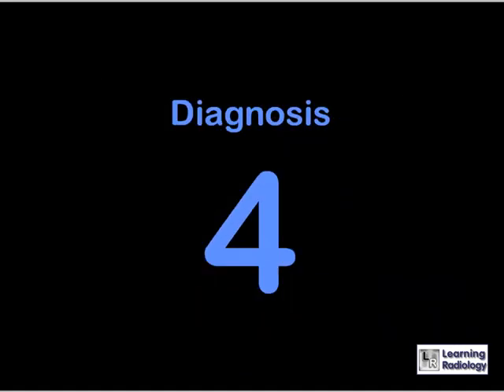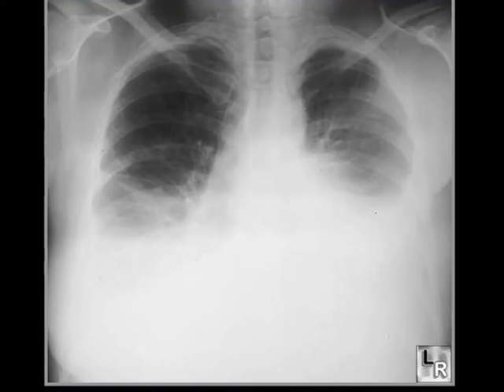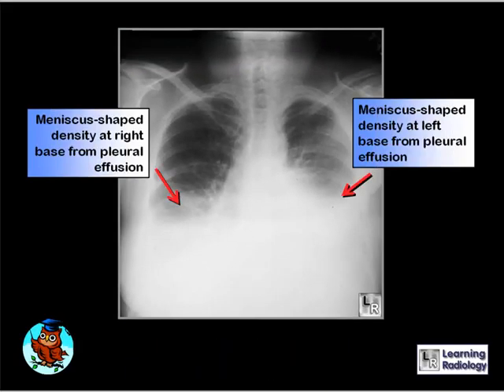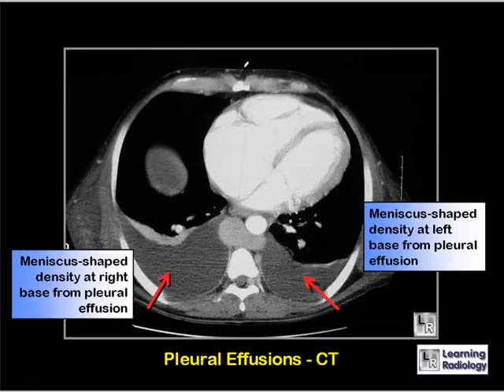Why is this 57-year-old female short of breath? There are large bilateral pleural effusions, with a meniscus-shaped density at the right base and one at the left base. In this case it was secondary to congestive heart failure. A CT scan of the chest shows bilateral meniscus-shaped effusions with lower density because they contain fluid, and there is compression atelectasis above the pleural effusion on the right side.